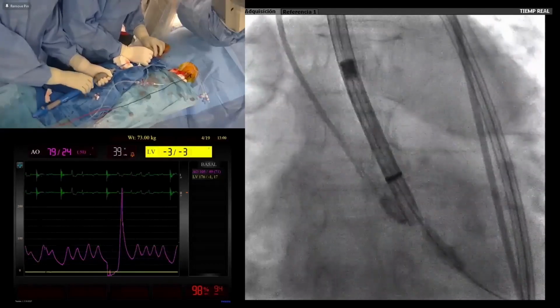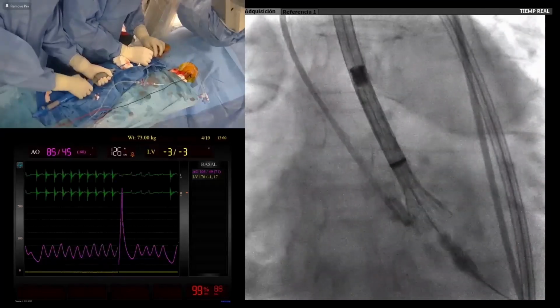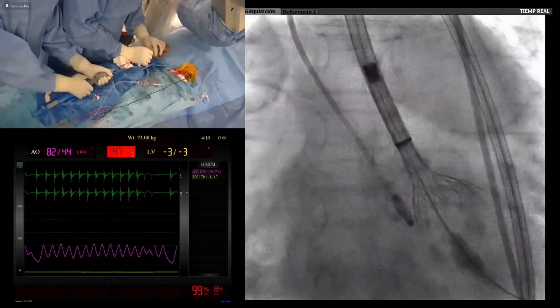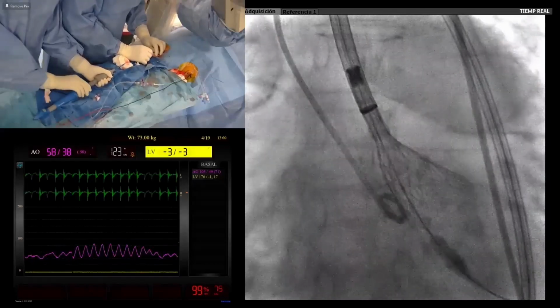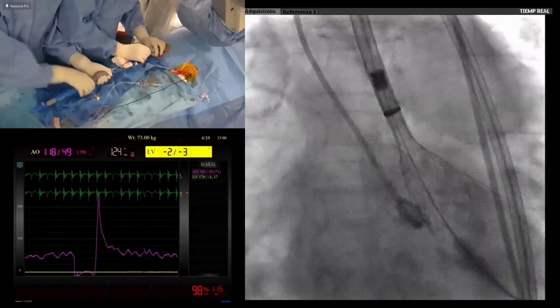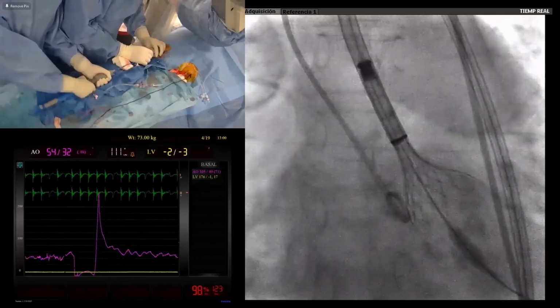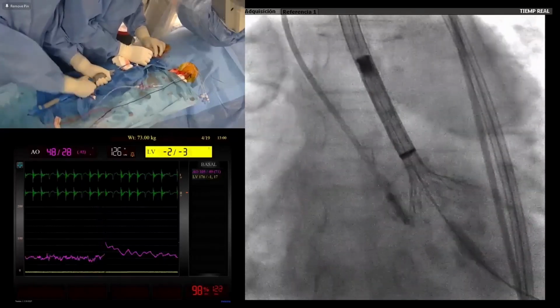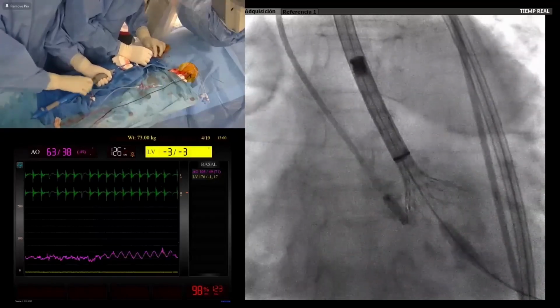Slowly. 120. Okay, Carlos, go. Test, no, we are too deep. Close it. Fast. The pressure is low there, Carlos. Let's go, let's go.